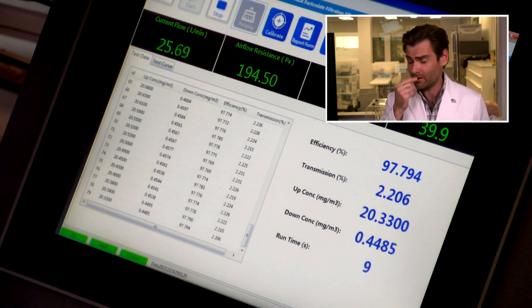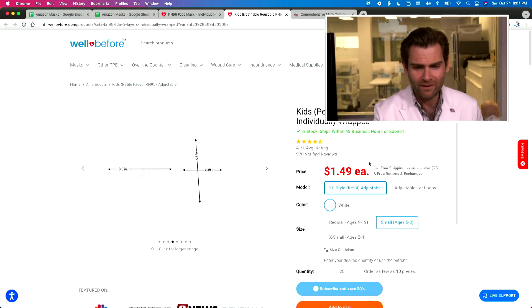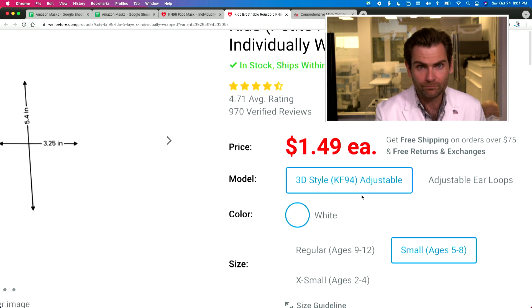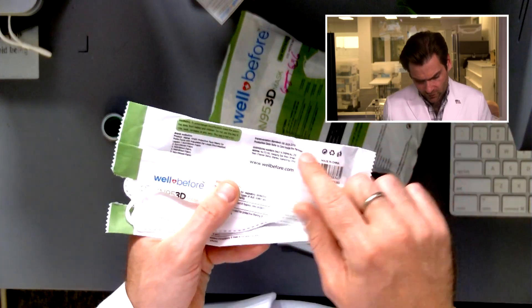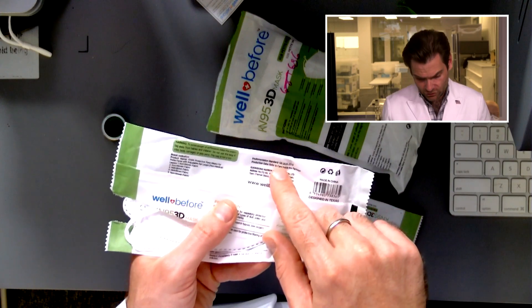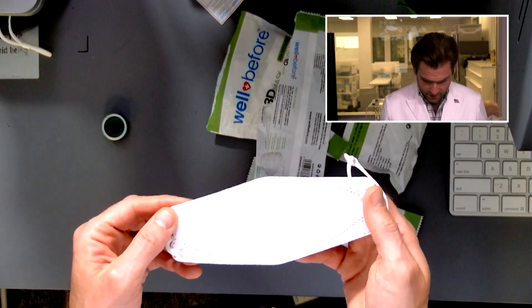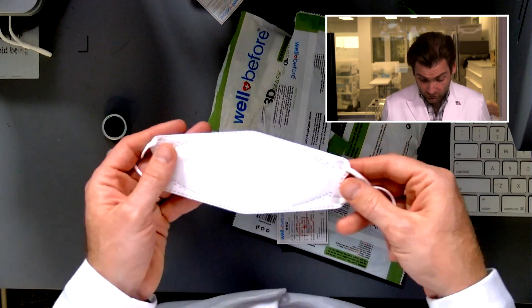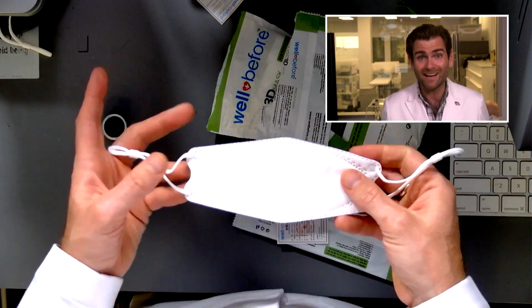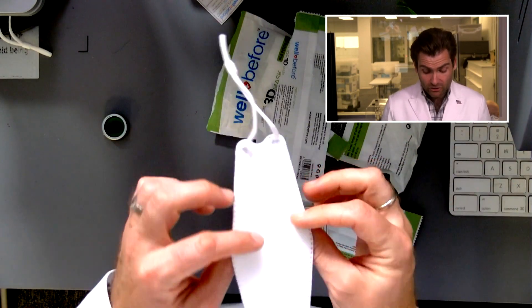This one is what they call — and I find this very weird — the 3D style or KF94 style. KF94 is a Korean style of mask. They're claiming it meets GB 2626-2019, which is the KN95 standard, but I can tell you just by looking at it, it's not part of that standard. There are no markings whatsoever on this mask.